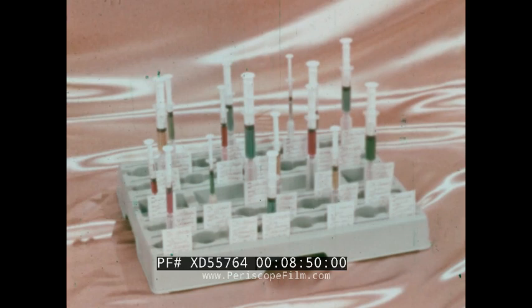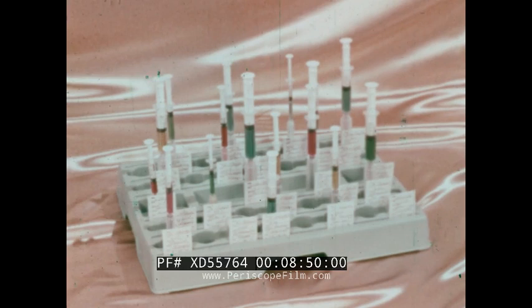This is the Monoject Injection System using the sterile platform technique: a built-in sequence of safety that protects the patient, all hospital personnel, and the community.